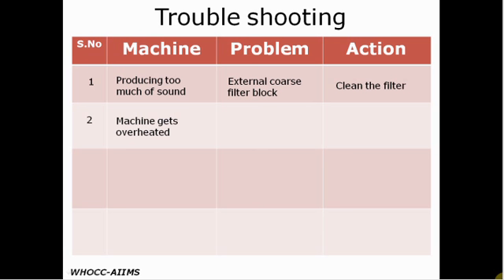If there is too much heating of the machine, it may be too near the wall. One should always keep it away from the wall, else it will decrease the efficiency of the machine. If one uses too many compressors in a room, the room temperature may increase. So, best is to house them outside the room or in open space.